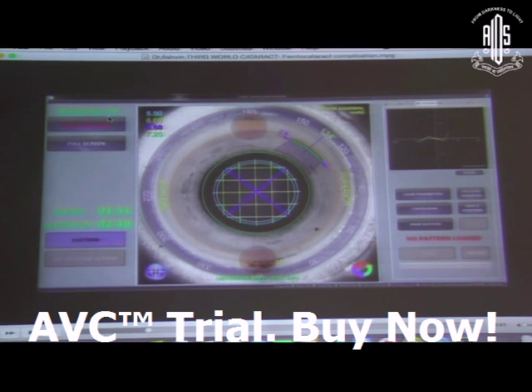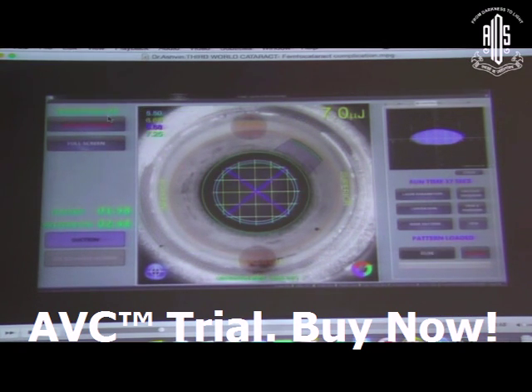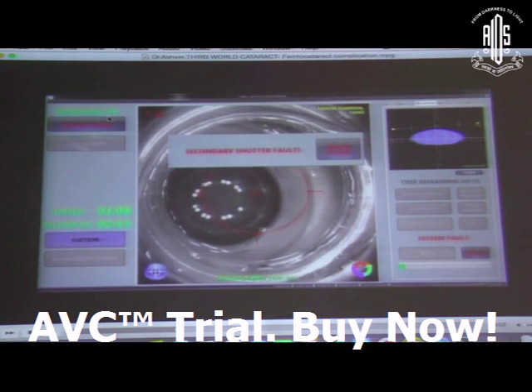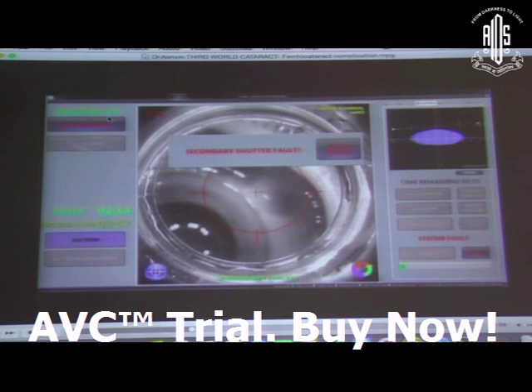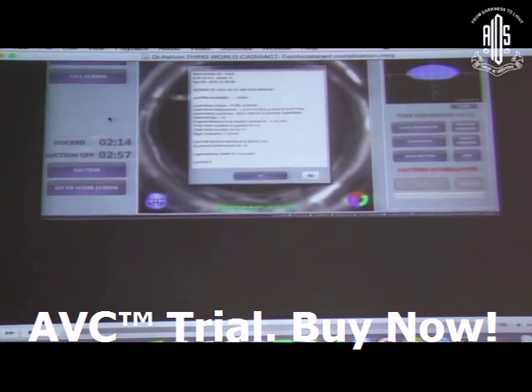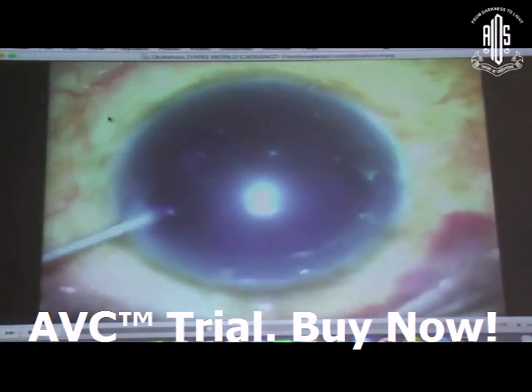You can see here the incision is being made, and this is being done by one of my doctors, Ashwin. Once the rhexis is done, the incision is done, and the fragmentation is done, and then we shift to the patient, you see certain problems come. You see here, there is a shutter fault coming in. At this stage you can't tell the patient too much because there has been some failure in the machine, obviously. So we take up the patient for surgery, and we try to see what happens then.